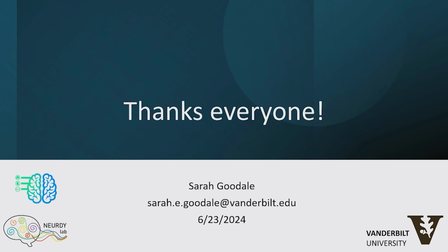So I would say really do those quality checks and make sure that before they go in, you're seeing good signal. That's tightening the belt, loosening the belt, adjusting the PPG. That can definitely play a big role in patient population, so it's always good to check those too. But sounds good. Thank you very much, Sarah. Is there any other final question?